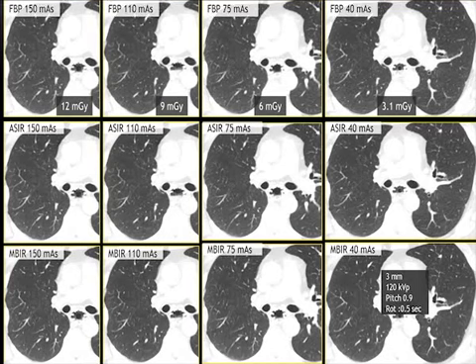And once again, in the lungs, this top row is with filtered back projection. This one is with ASiR. This one is with MBIR. Hard to find any differences.